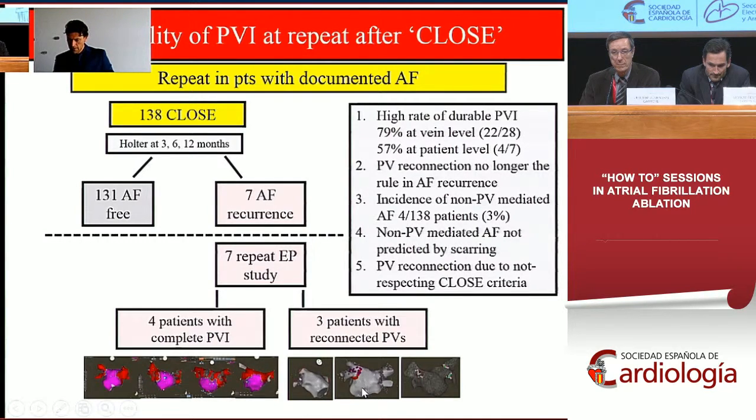The number 2 patient, I remember that patient as well. There was a reconnection at the posterior-inferior left inferior PV. And there we did not respect the interlesion distance. Why? I don't know. Maybe there was esophageal or we did not pay attention when we controlled. There I had a very single gap. You see slightly more RF lesions because I know what happened. When I touched that region, mechanically it was already blocked. So then I said, oh, I know where the gap is, but I wanted to be a bit more sure. So this patient had a distance.